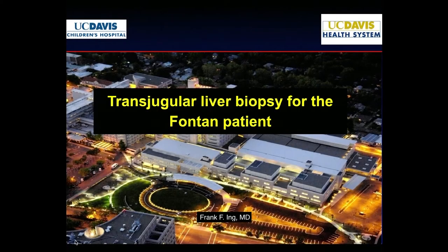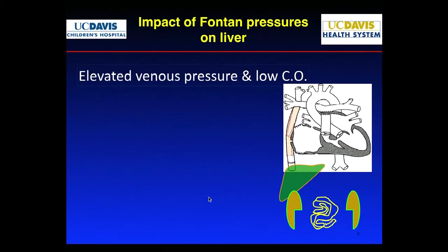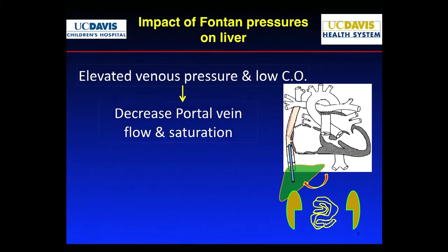This is, again, not a specific case, but just to talk about a newer procedure that we've been doing with some of these Fontan patients, and it's the transjugular liver biopsy in the Fontan patients. Now, you guys know that with the Fontan physiology, the venous pressures are increased, right? That makes sense. Output may be a little lower, and as a result of that, the higher pressures can impact the liver over a long period of time.